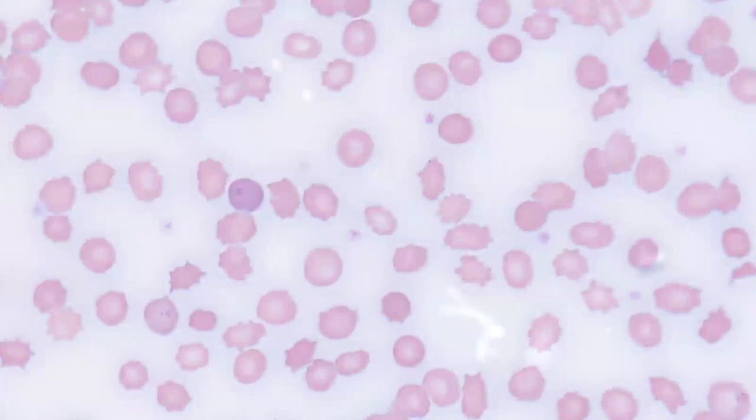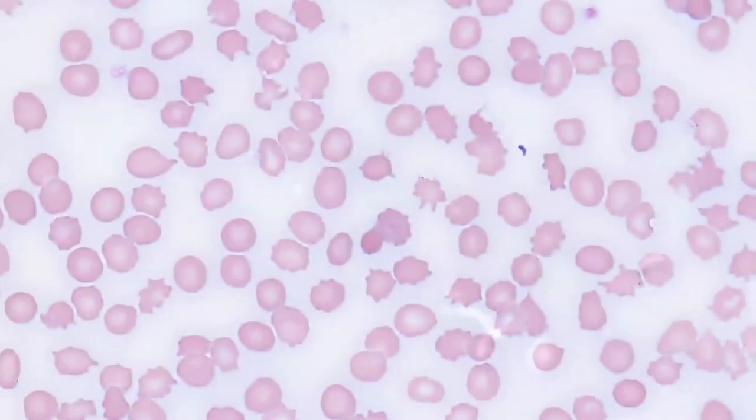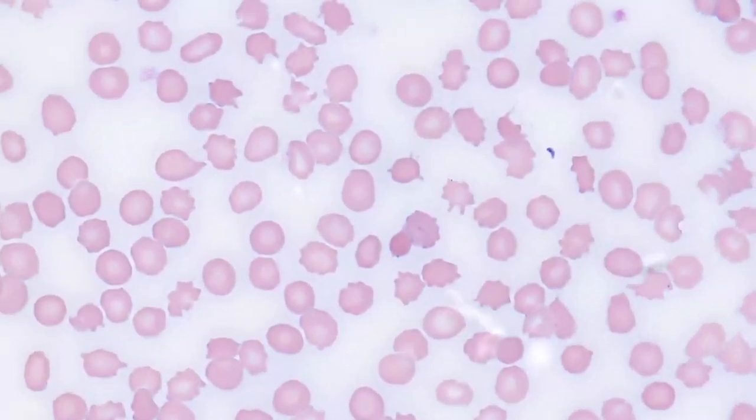There are also some areas where the blunt projections become pointed projections, and this is a different cell type that we'll talk about next. A number of different artifactual or environmental conditions, such as pH, albumin concentration, among others, may transform the red cells into echinocytes. The most common cause of true echinocyte formation is an artifact of smear preparation.